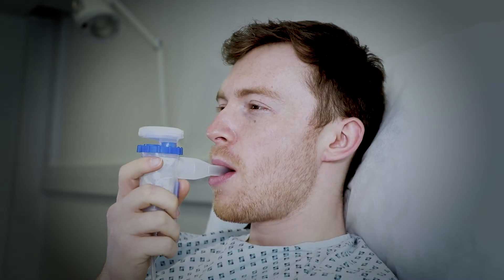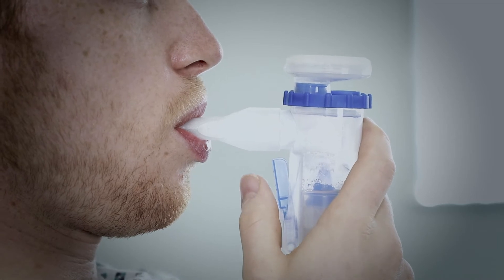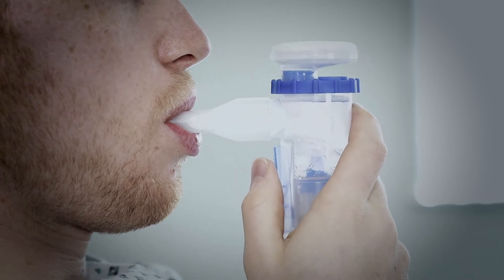Because of the proprietary design of the nebulizer, MaxiNeb Duo is able to create particles faster, speeding up patient treatment and improving patient compliance. The average treatment time is below three minutes.